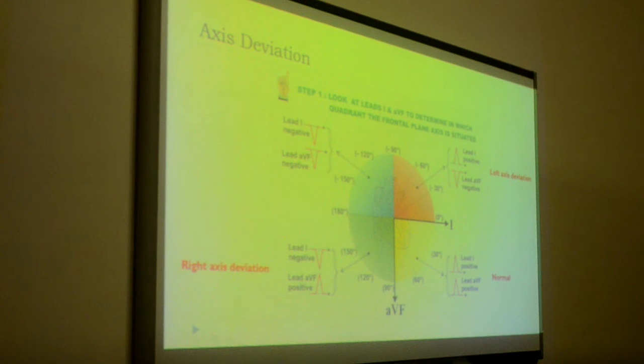If you have hypertrophy of the left ventricle, there will be a lot more impulse going towards the left side than towards the right. The balance will be shifted more towards the left because there will be more cardiac muscle on the left side, so more electrical activity there. The opposite happens for the right side. There are other causes like bundle branch block, but sometimes it's really difficult to understand why. So I don't want to confuse things, and mainly I don't really know why. Let's just focus on the axis deviation itself.